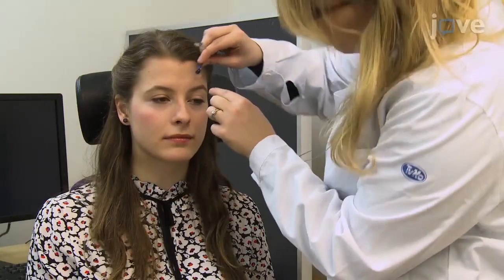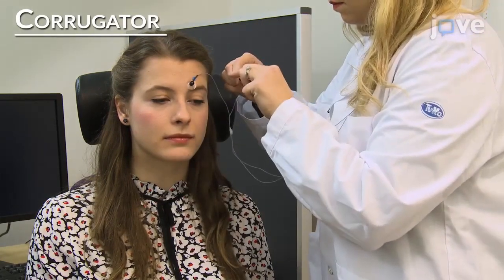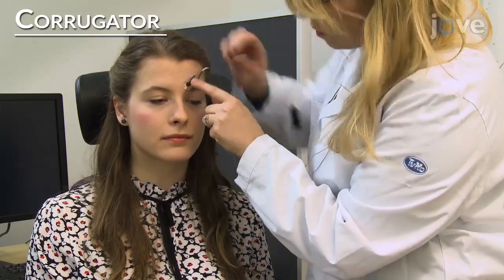Then affix one electrode directly above the eyebrow along an imaginary vertical line that traverses the inner corner of the eye. Place the second electrode 1cm lateral and slightly superior to the first along the border of the eyebrow.